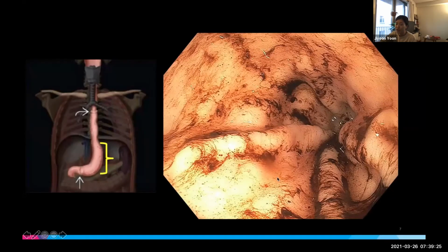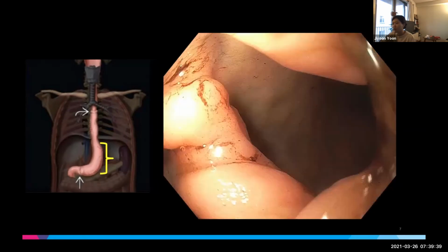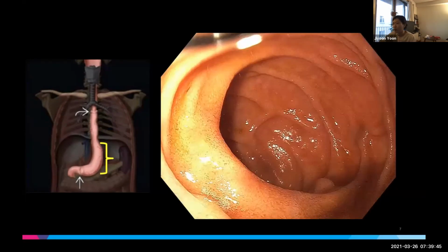This is her conduit beyond the diaphragm. So everything looks pretty good, normal mucosa. We passed through the fold pretty easily without any resistance. This image is of the pyloroplasty. It's wide open, no resistance to passing the scope. And then beyond that, the duodenum was entirely normal.